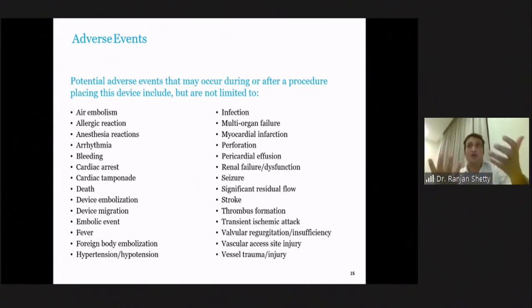You have to be much more careful. The sheath should not be going in and out without a pigtail. If you think you need to reposition the sheath, feel free to retake the pigtail. Make it go to the topmost loop.